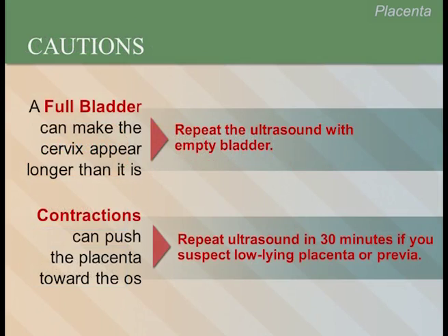Be aware that some conditions can distort how the placenta is truly positioned. For example, a full bladder can make the cervix appear longer than it is. If the bladder appears full, ask the patient to empty her bladder and then repeat the ultrasound.